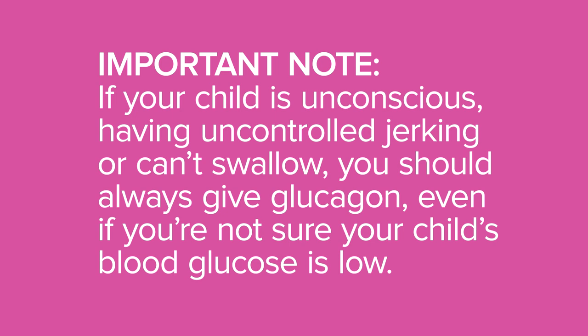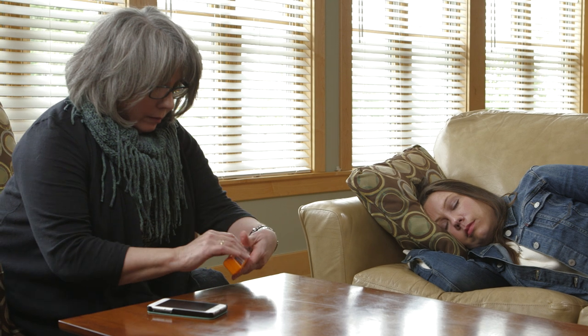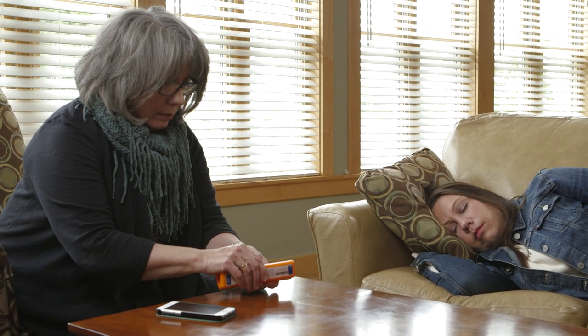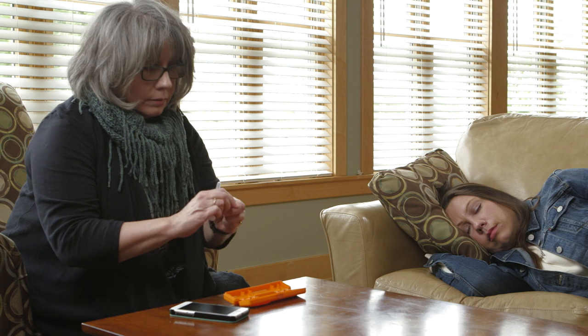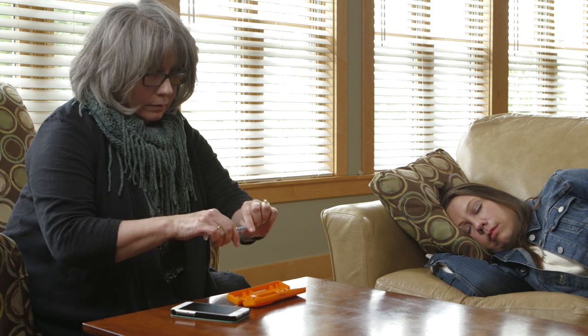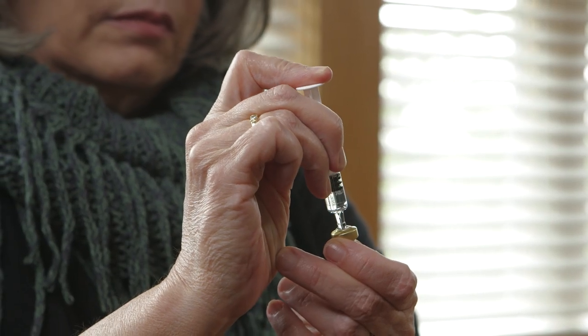Even if you're not sure your child's blood glucose is low, give glucagon. Find the bottle of glucagon in the kit. Remove the flip seal from the bottle, remove the needle protector from the syringe, and inject the entire contents of the syringe into the bottle of glucagon.